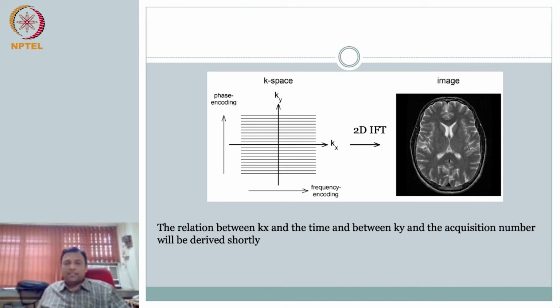Clearly, you can see this is a fantastic image, but it's really complex to visualize that it is coming from this data acquisition and this data alignment. But such is the beauty of MRI, that you can do several things, but to get this basic feel for what is this gray, what is this black, what does this mean, is not straightforward. I hope you repeat the physics lectures and then repeat the data acquisition lectures and get a feel for it, because the reconstruction lecture is straightforward. If you understand this, taking inverse Fourier transform coming here should not be that difficult to understand.